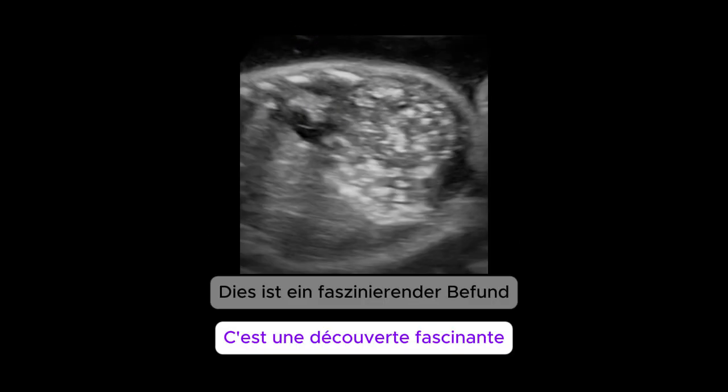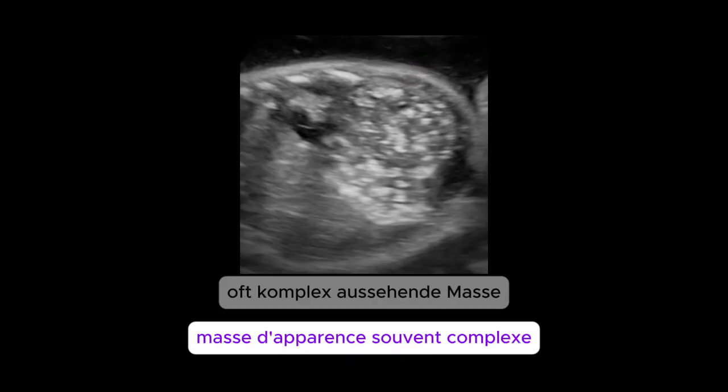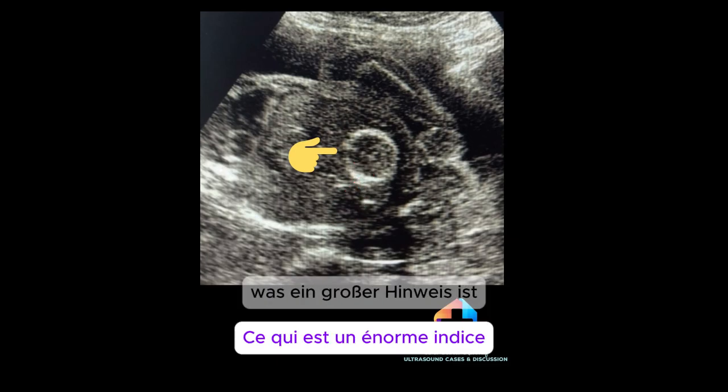This is a fascinating finding. The body tries to wall off the leaked meconium, forming a cystic, often complex-looking mass. Sometimes, these pseudocysts have a thick calcified rim, which is a huge clue.